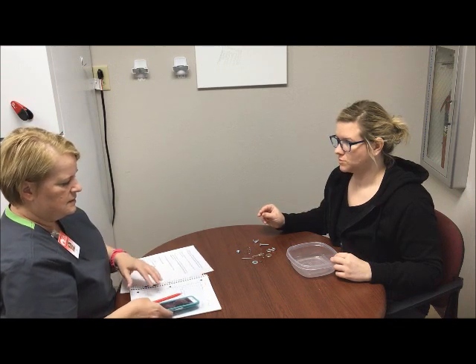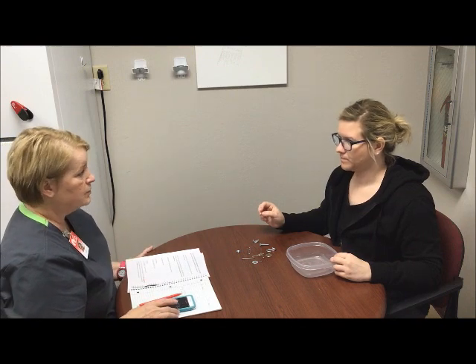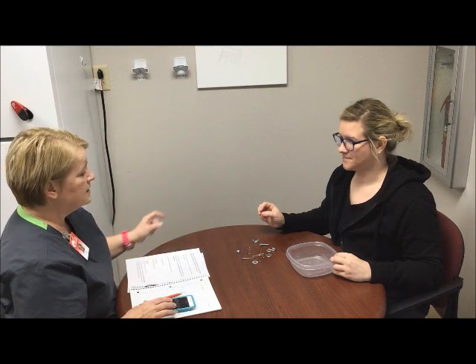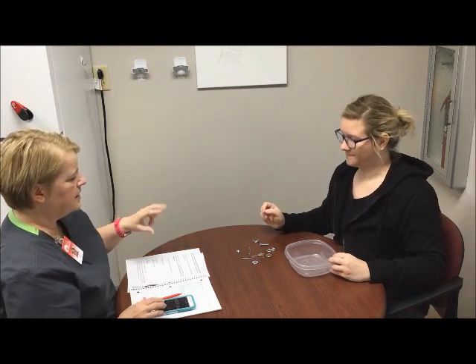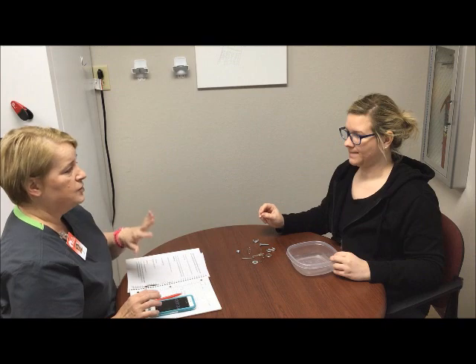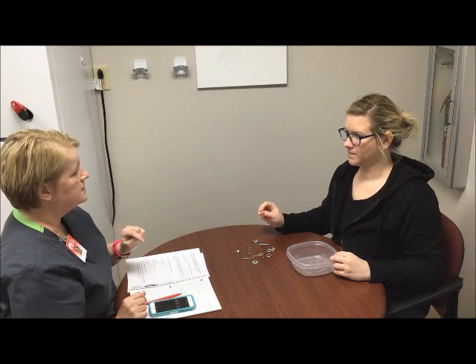I'm going to start my timer here. When you're ready — do you recognize what everything is there? And I'm just using those two fingers? Those two fingers and your thumb. You can't slide anything off the table to pick it up, and you can only pick up one thing at a time.